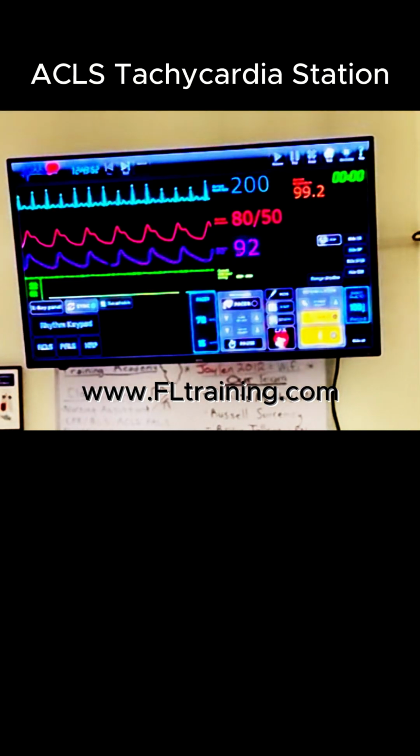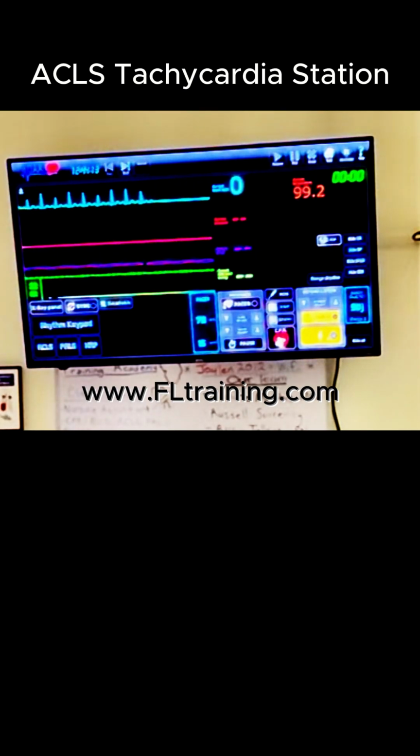Okay. And this will be based upon your facility, the make and model of your device. I can't tell you how much energy to give. We're just going to do this for classroom purposes and do 50. All right, everybody's at the bedside. Your machine is charging. Make sure we're all clear. Everybody's clear. All right, firing on 3, 1, 2, and 3. All right, shock delivered. We don't treat monitors, we treat people.